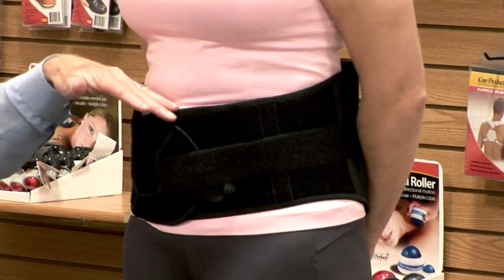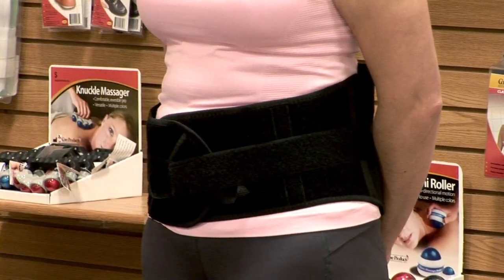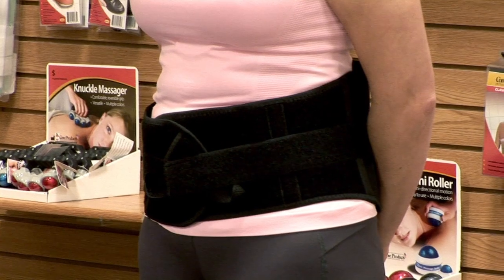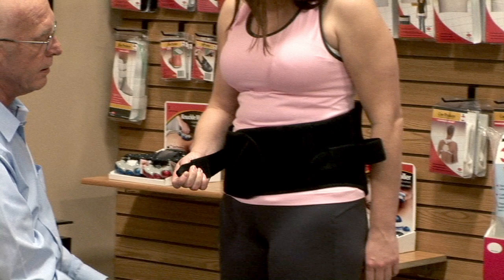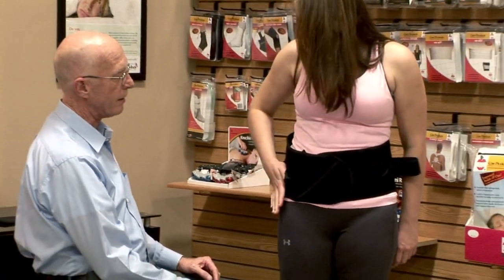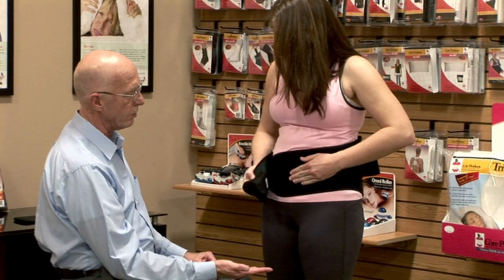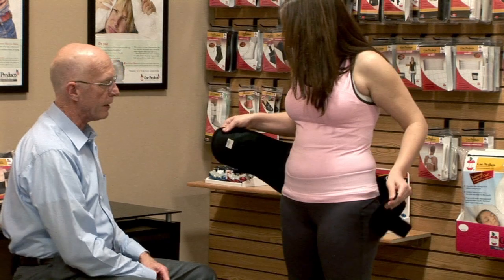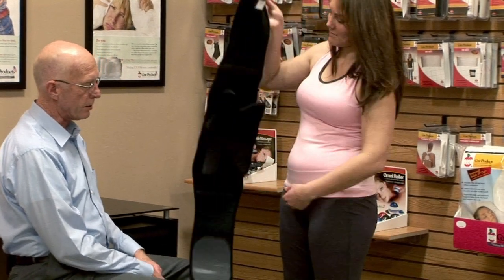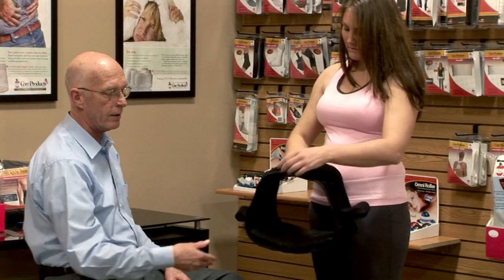We're teaching the patient how to use this. She's not feeling really great support yet because she can get better support than I can apply. So we teach the patient how to take it off — that's simply undoing these straps and touching them way back here. Make sure they touch down way back there. Then open it up and just roll your hand — that'll take it off. If she's putting this on the bed stand at night, make sure to touch that down so it won't get tangled with anything.